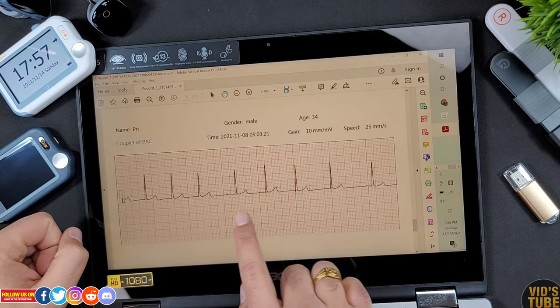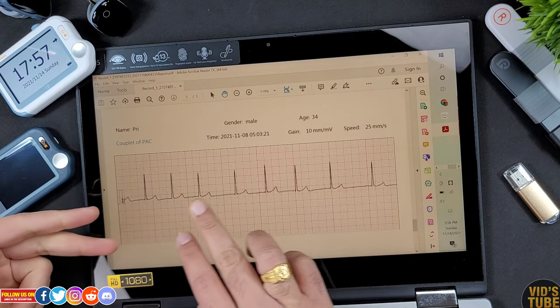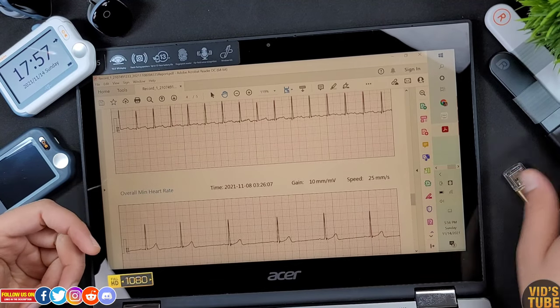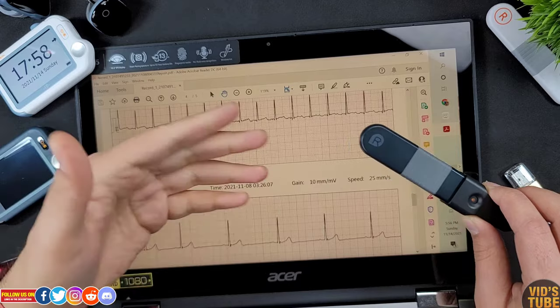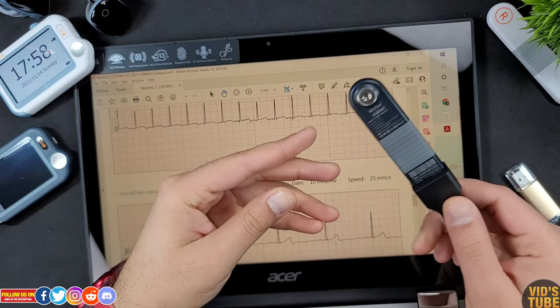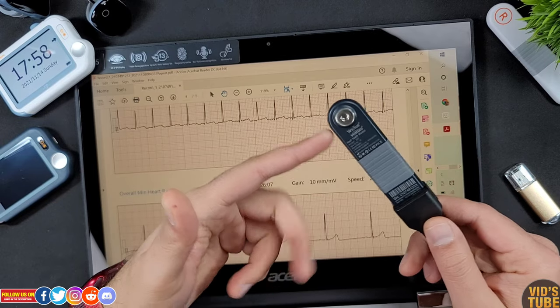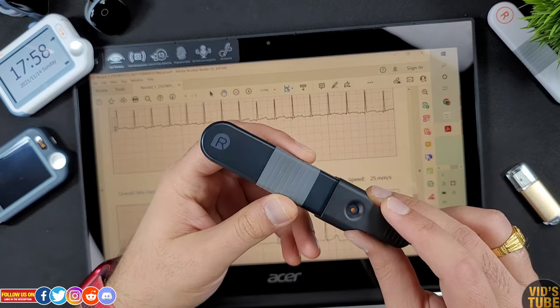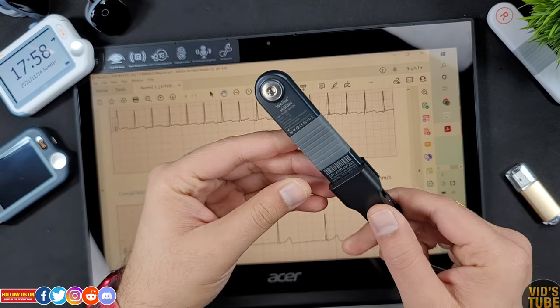Being a registered physiotherapist with knowledge of cardiology, and having put this device to the test, I have seen that for the most part this device does what it is intended for. Certainly it cannot substitute a diagnosis from a medical doctor, and it is not a 12-lead ECG, but it can be an adjunct and a good resource.